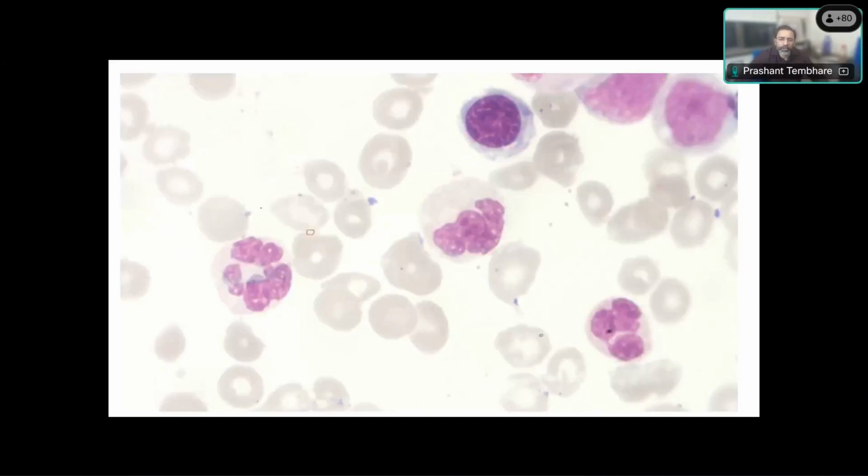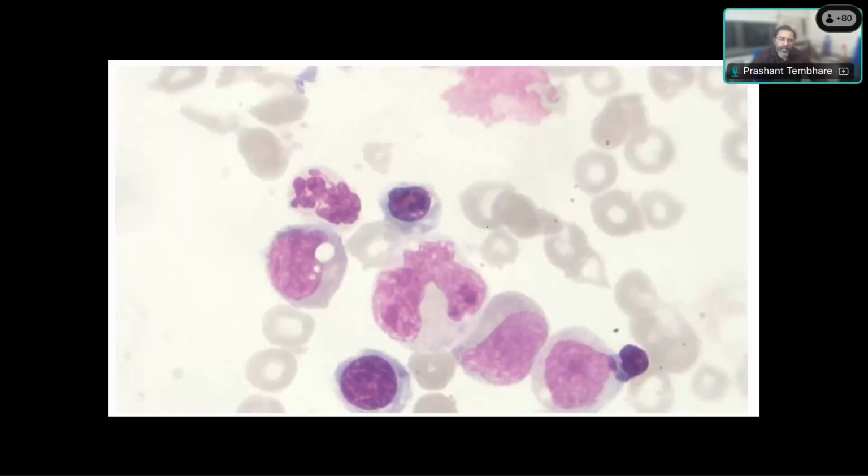This is a picture of bone marrow. You can see some segmentation-related abnormality, and clearly hypogranulation; you don't see the granules. There is abnormal dysplastic segmentation. Even the erythroid cells show dysplasia at this stage. Hemoglobinization is there, but nuclear-cytoplasmic delay is also there. There is some dysplasia in the erythroid series, and hypogranulation of the myeloid series.